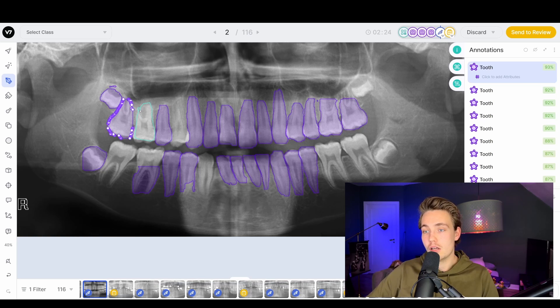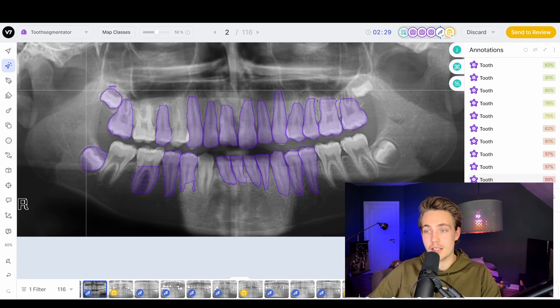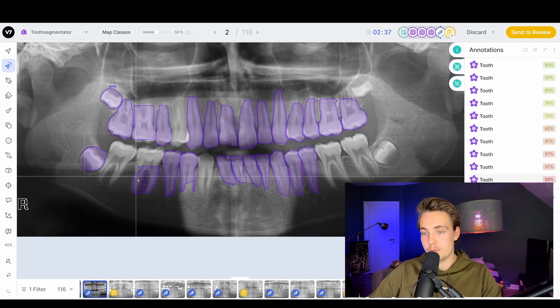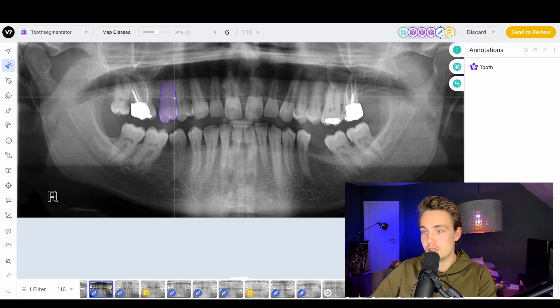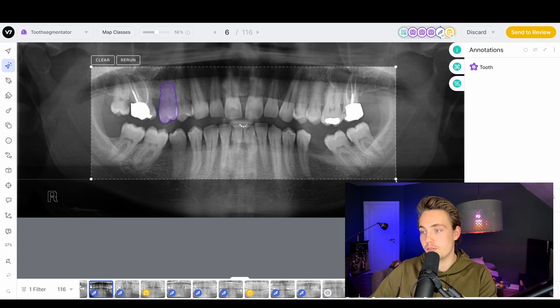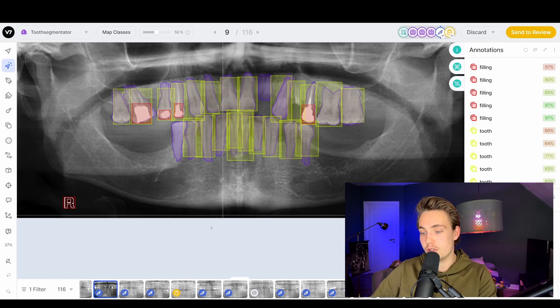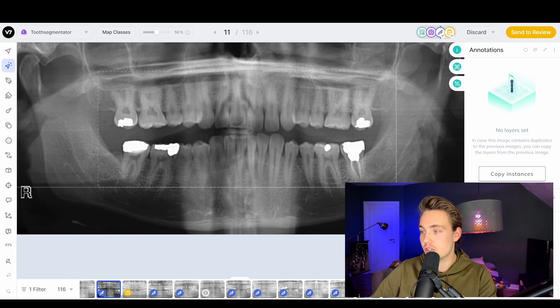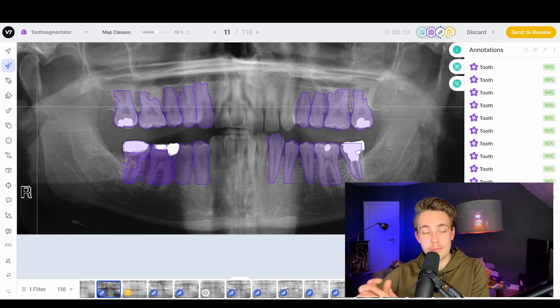Just run the tooth segmentator and you're basically set to go. You can directly throw it into review stage and manually label the remaining teeth it hasn't detected. Let's try using the auto annotation tool with a bounding box around just one tooth. We're getting some detections but also some errors - it's drawing more straight lines. Testing another image, we already have one detection, and running it again gives really nice results - most of the teeth are detected. On yet another image with no annotations, we just draw a bounding box around the area for segmentation and the results are way better than if we had to manually label from scratch.